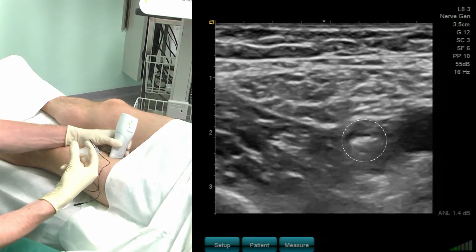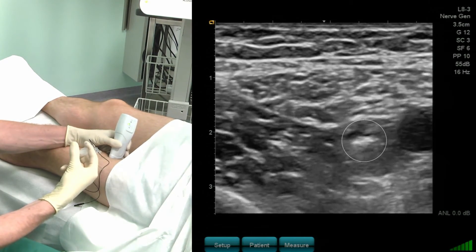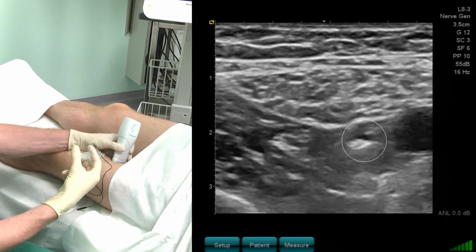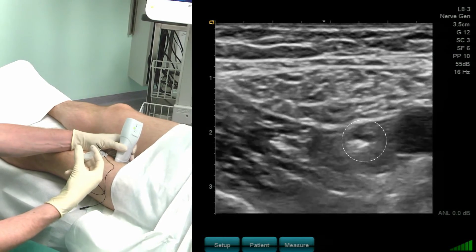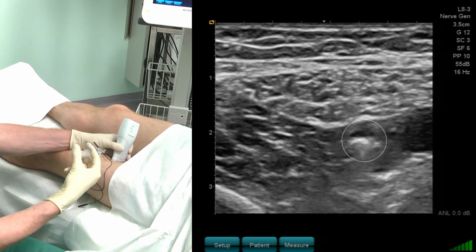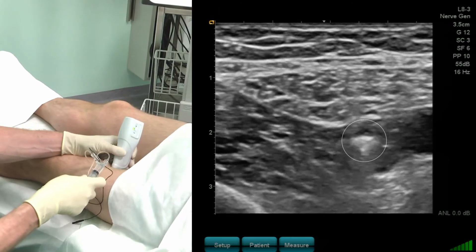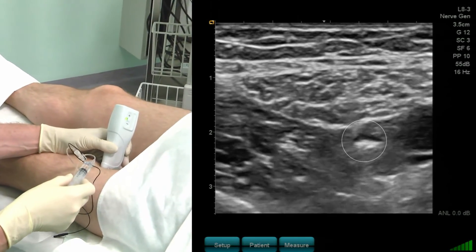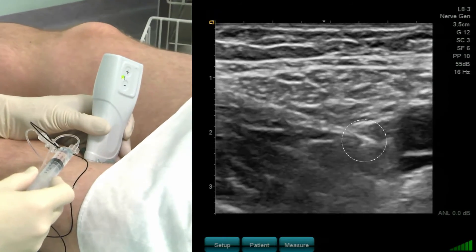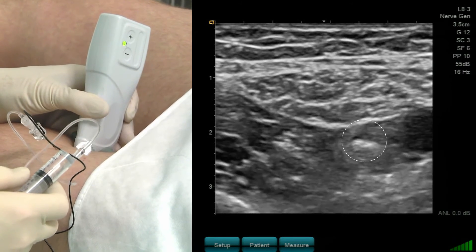While I inject, the saphenous nerve can be seen even more clearly. Here is the needle, and I move the probe a little bit caudal — here the nerve can be clearly seen. It is nicely surrounded with local anesthetics. I have only injected five mLs of local anesthetics.